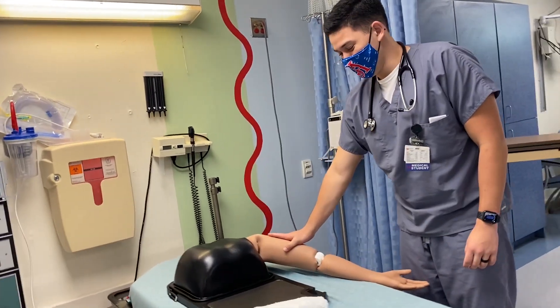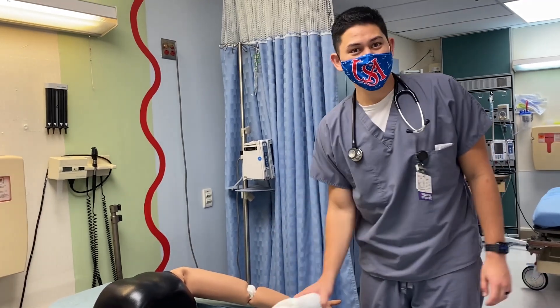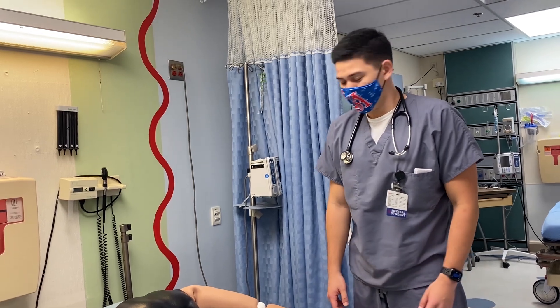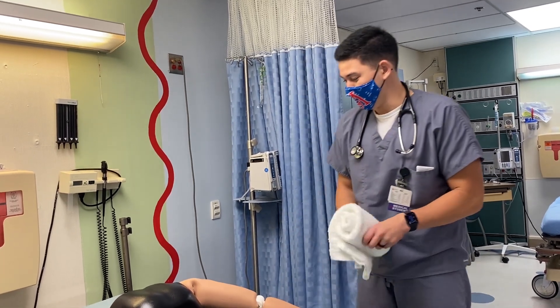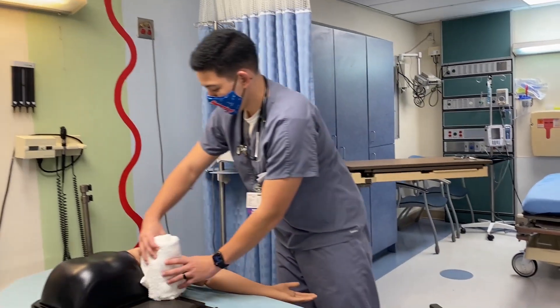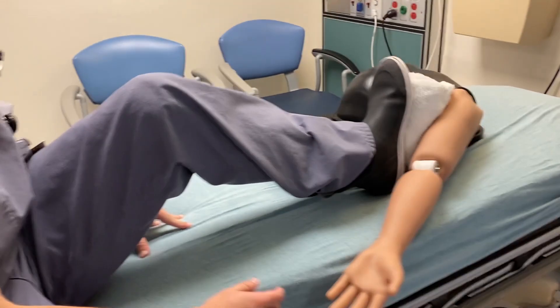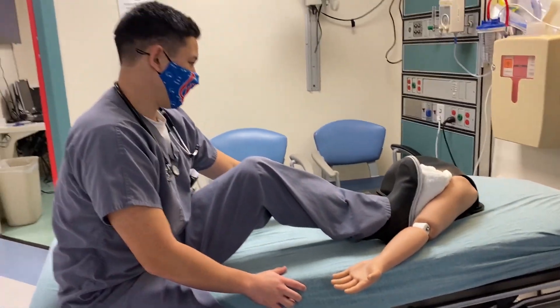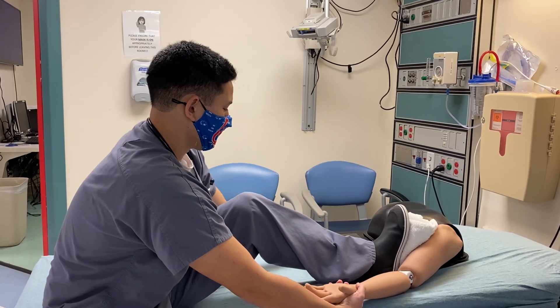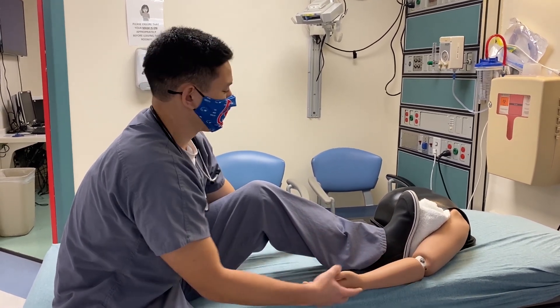We have an anterior dislocation and we're going to relocate using the Hippocratic method. This method is not recommended due to risk of neurovascular damage, but we'll demonstrate it. You can take your shoe off and use your sock, or use a towel placed in the patient's axilla. Place your foot in the axilla and apply traction to the arm to reduce it.